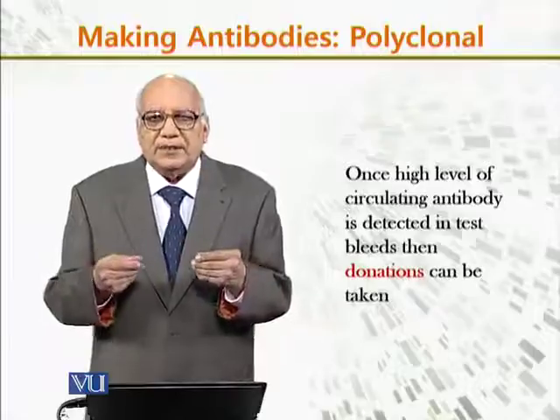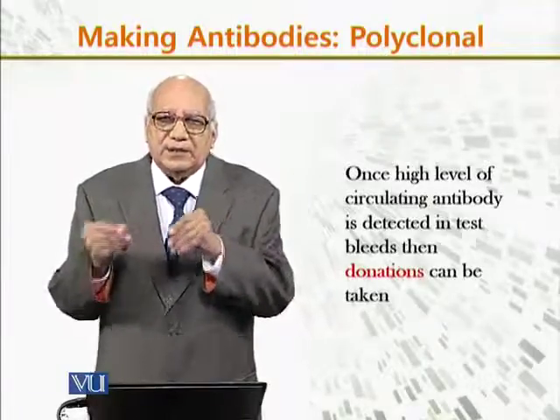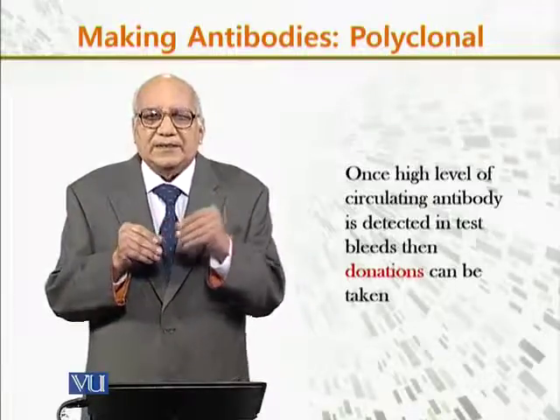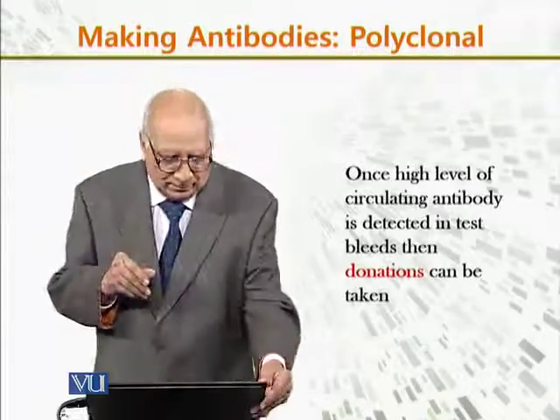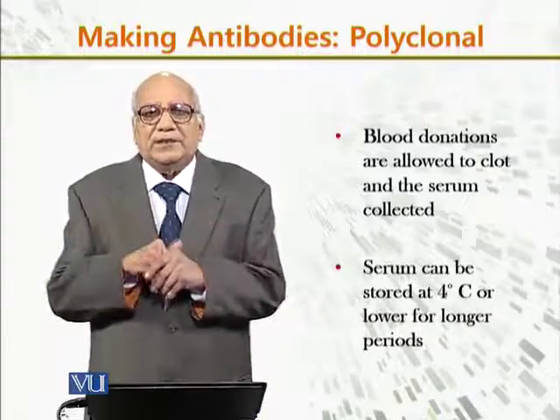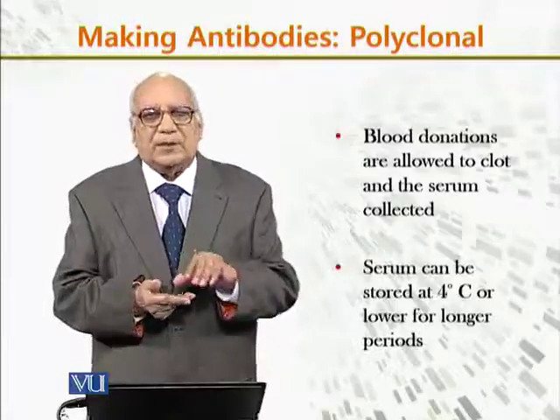The animal is bled and its blood is taken. The blood donation is allowed to clot, and the serum is collected.